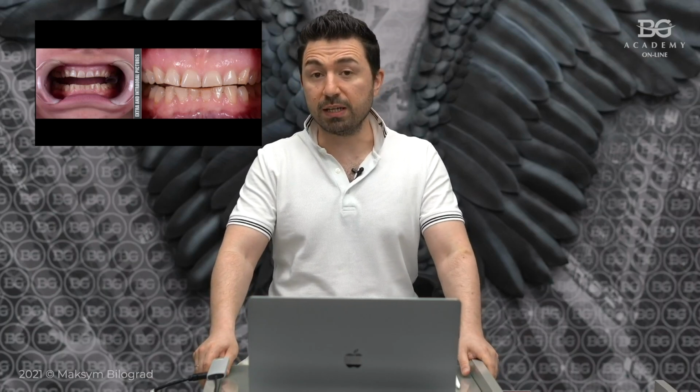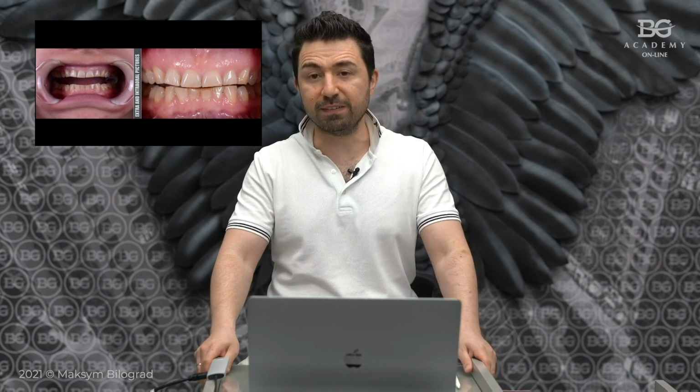The new BG Dental case is dedicated to a variety of porcelain partial restorations for posterior teeth like veneers, veneer-lays, and veneer overlays. So keep in touch, let's watch it, and let's go.